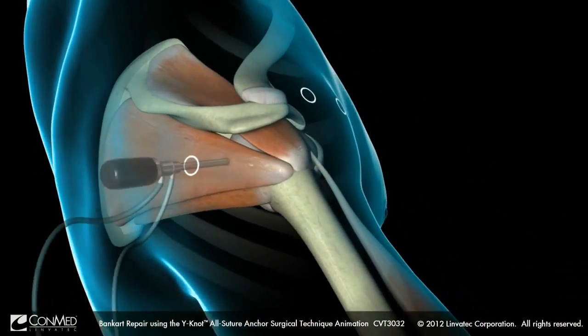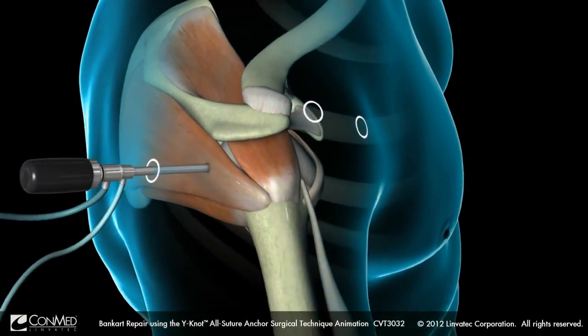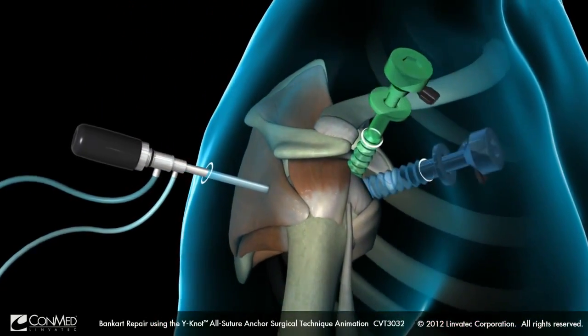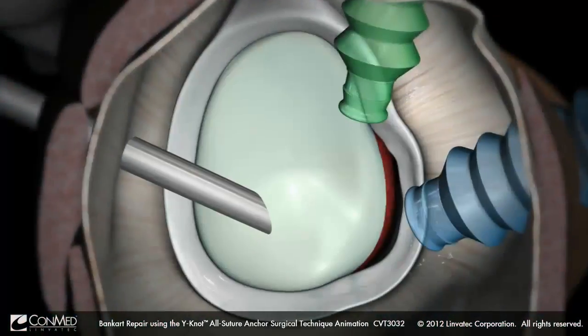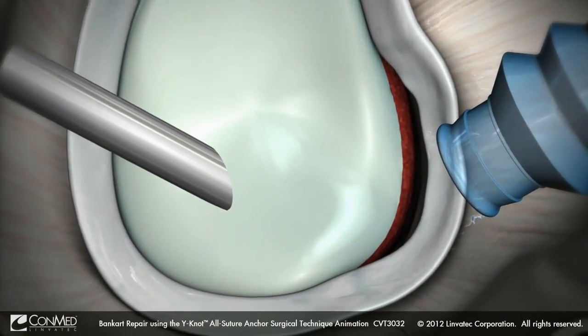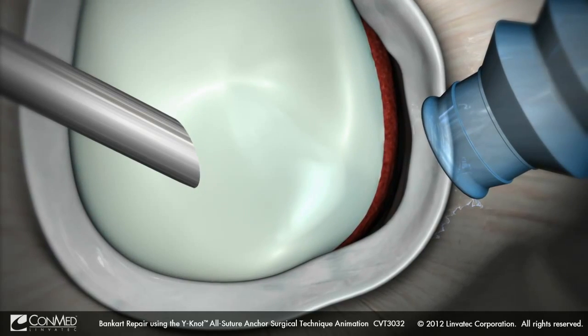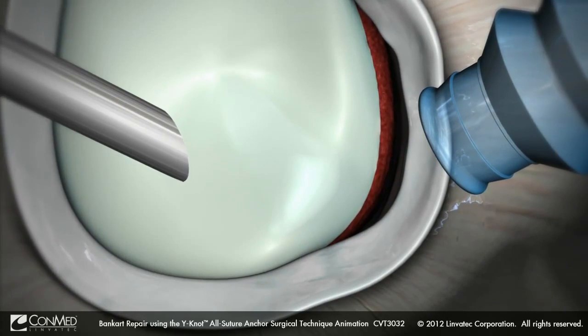Begin by establishing dual anterior portals at the superior and inferior margins of the rotator interval. A healing surface is generated by abrading the anterior inferior glenoid rim with either a rasp or mechanized burr.